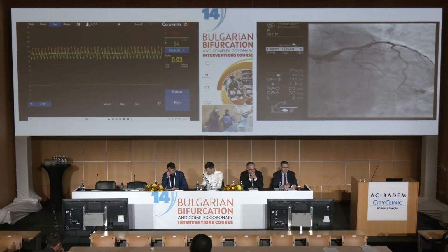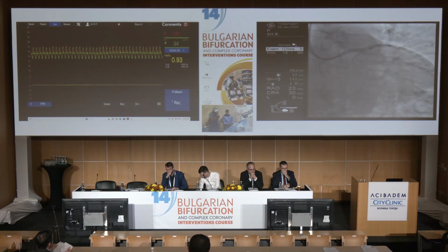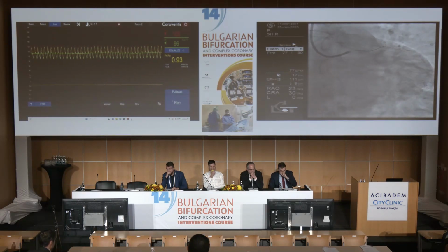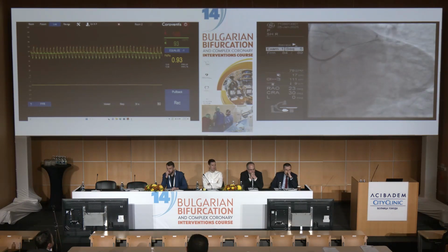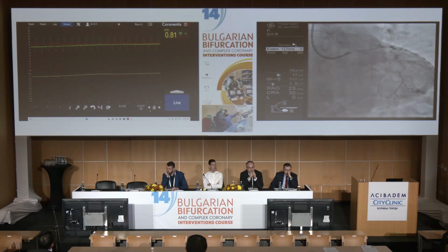And while waiting for you, Valérie already did two things, namely fractional flow reserve measurements, and we will show you the tracings here. If you could show, yeah, that's ideal. That's ideal to have both side by side. That's fantastic.